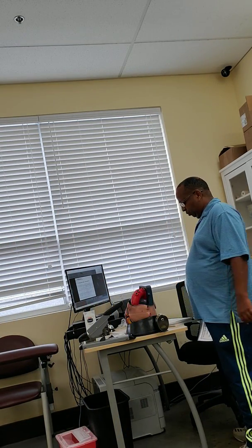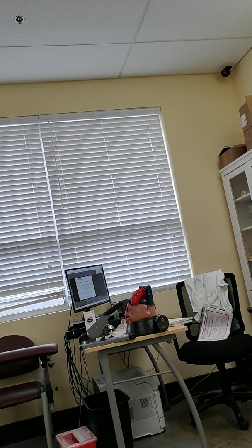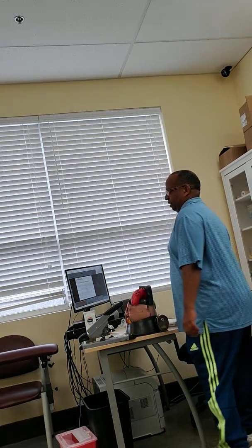Then the next will be what? PR interval. So PR interval means the distance from the beginning of P to the beginning of Q. And you count the little boxes and multiply it, because we said each box is how much? 0.04 second. So multiply that and then you will get it. Should it be called PQ? Yeah, if you go to Britain, this is PQ. But here it is PR. Why?